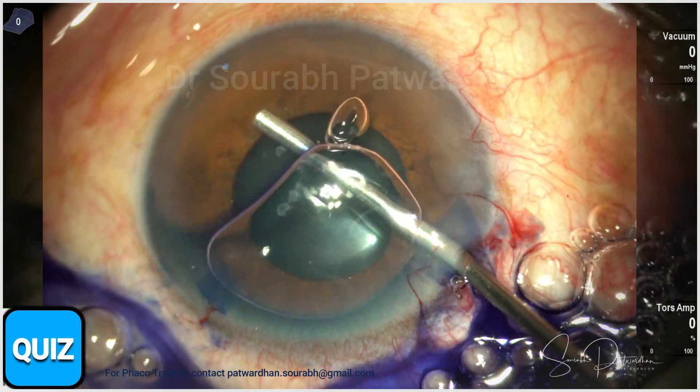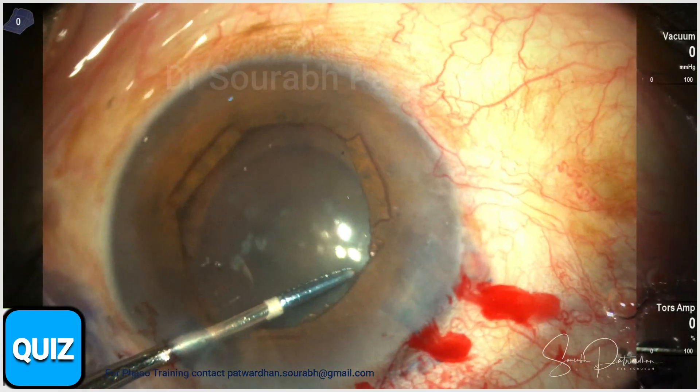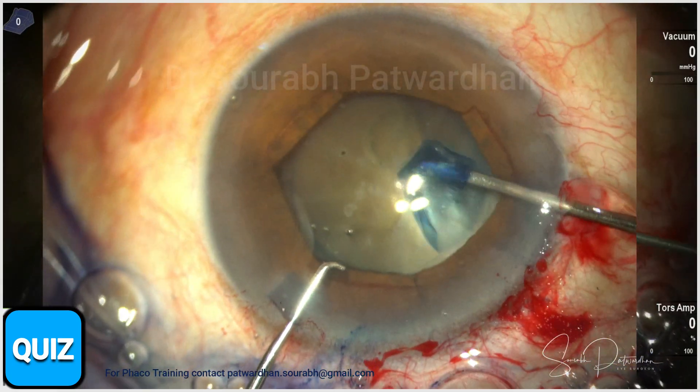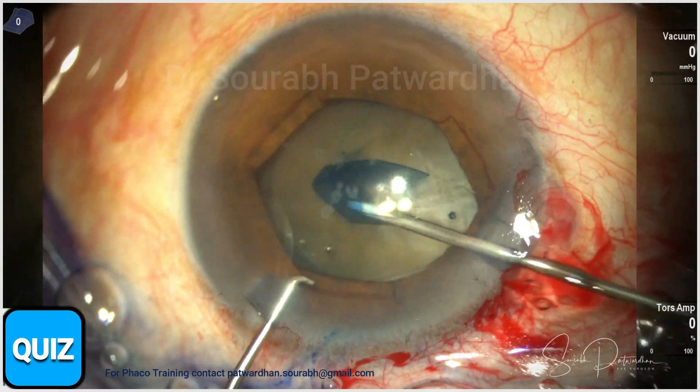This is a brown cataract — you can see it's a hard cataract. There is some corneal opacity and a small pupil. I want to take care of the pupil first, so I used a B-Hex pupil expansion ring followed by a capsulorhexis.